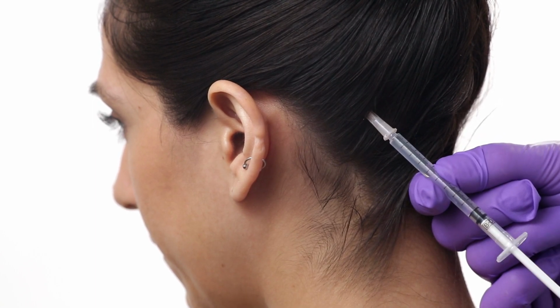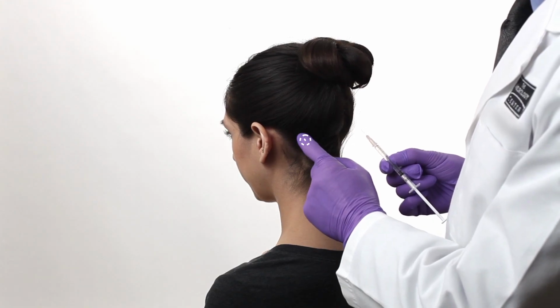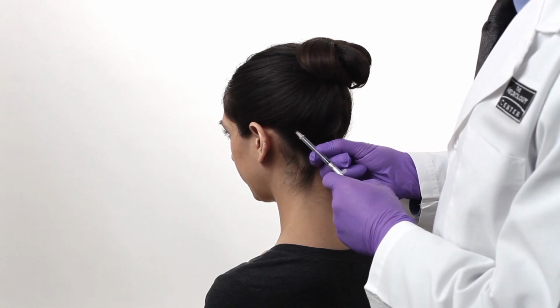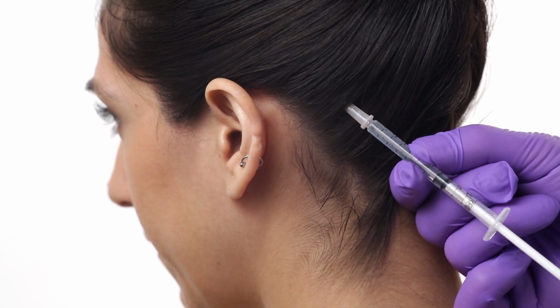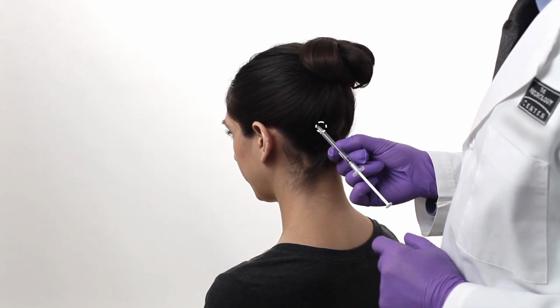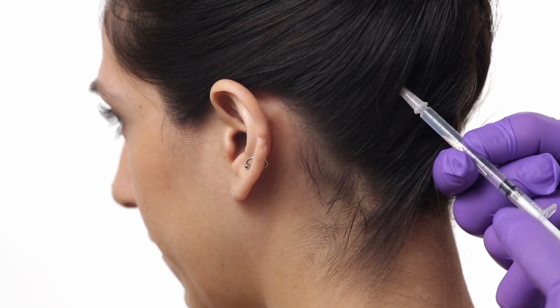Then inject Botox superficially. For the second injection, measure diagonally 1 to 2 fingers breadth up and out toward the tip of the ear at the 10 o'clock position. Stabilize the hub of the needle, again with the bevel of the needle facing up, and make the injection. To locate the third injection site, measure diagonally 1 to 2 fingers breadth up and medial from the first injection at the 2 o'clock position.